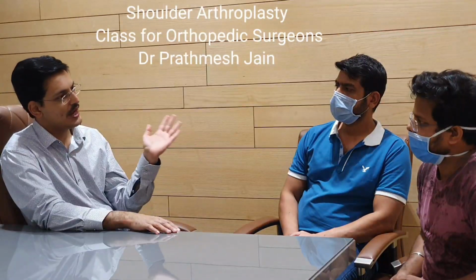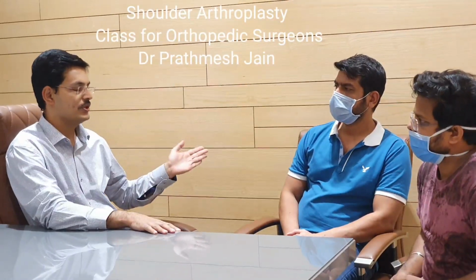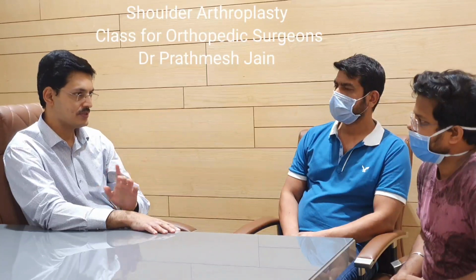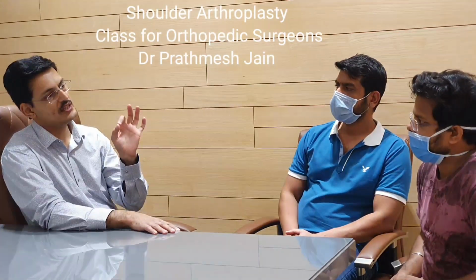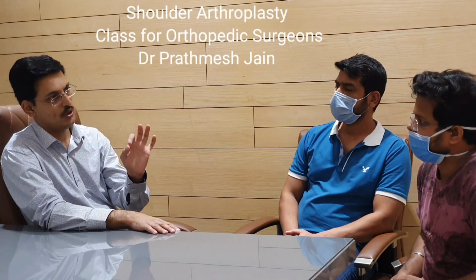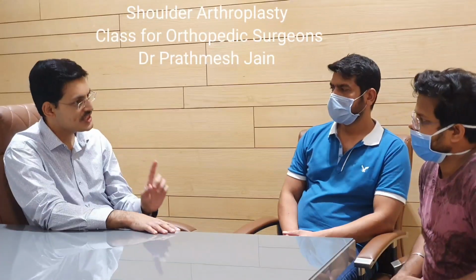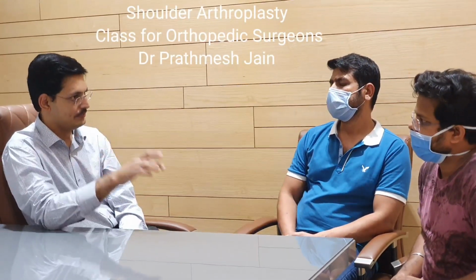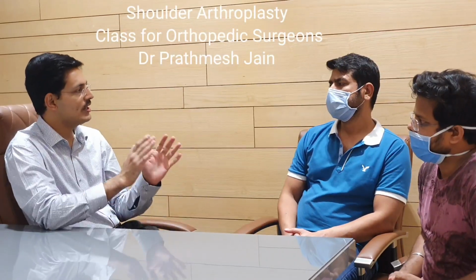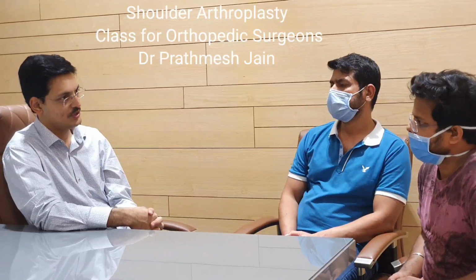Predominantly, we like to use a hydroxyapatite coated or some kind of coated stem for both glenoid and humerus. Apart from the cases in which there is a fracture or tumor, in the rest of the cases cement is not needed. If you have a fracture case, then you can use a humeral stem with cement. In the rest of the cases, you can do an uncemented reverse shoulder arthroplasty very successfully.